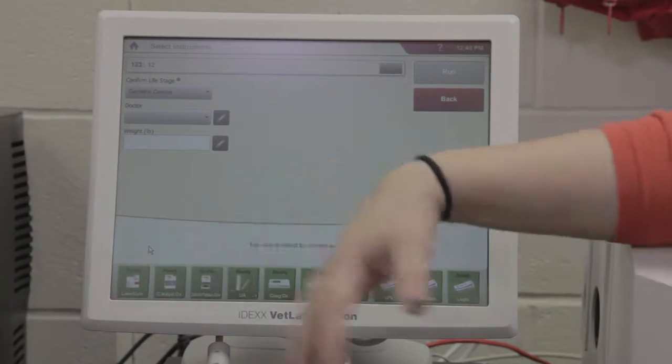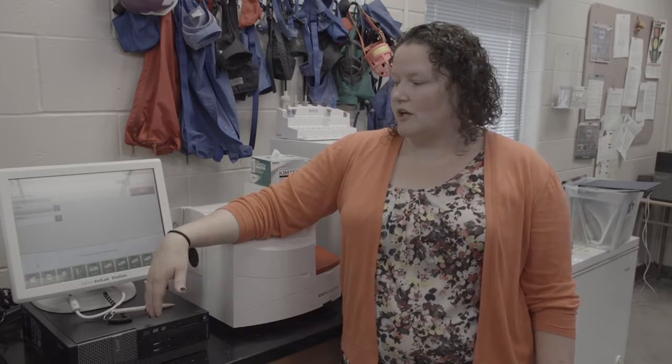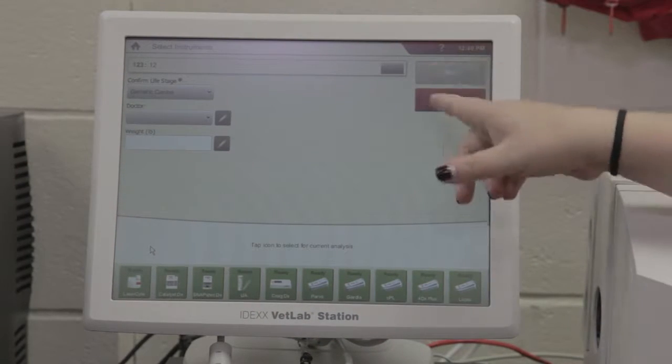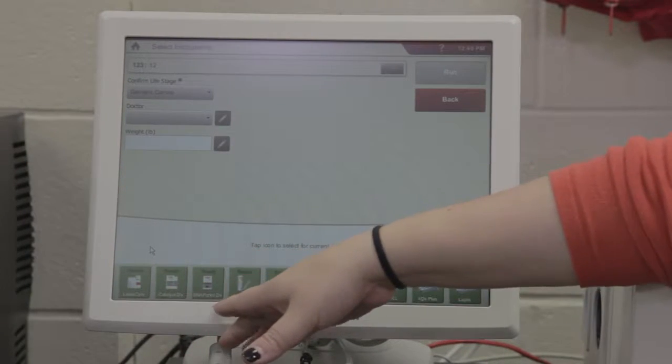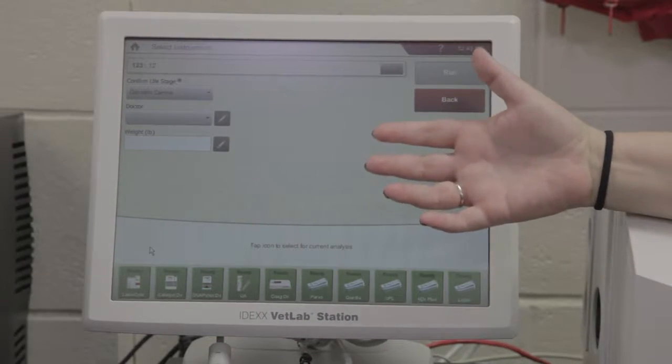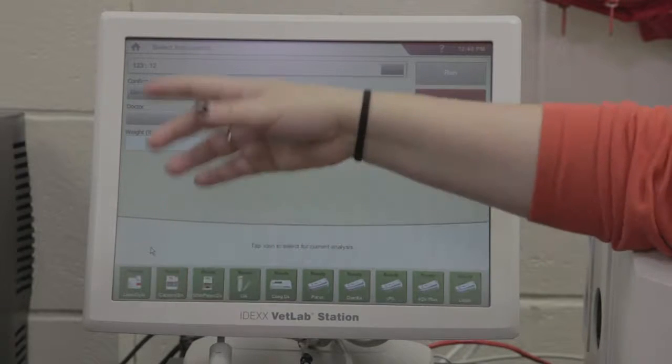So keep that in mind when you're in a busy practice and things get kind of busy. You do have the option to still manually run it on the counter and enter your results on here, so everything's still captured. So we will choose the analyzers that we want to run, and then that will send the information to those analyzers, and then we'll work from there.